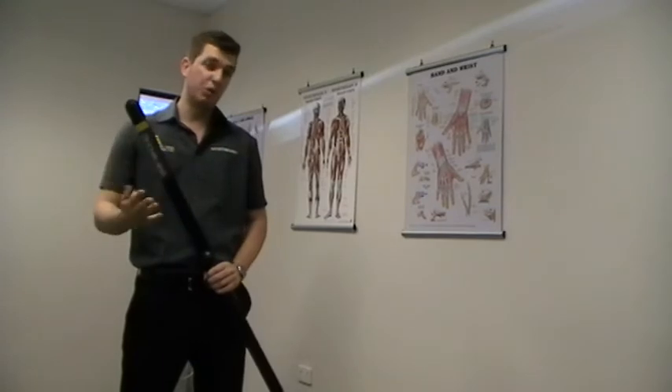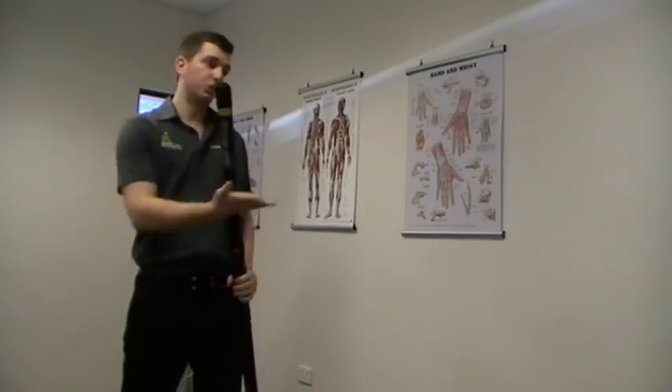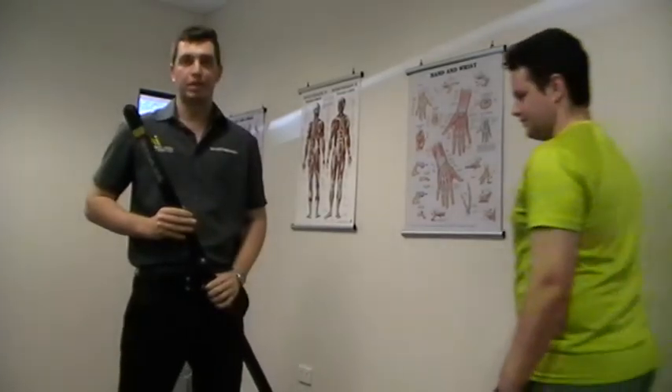It's to take your shoulder rehab to the next level, instead of just sitting there all day with an elastic band. I've got Jordan to help me demonstrate the Body Blade today.